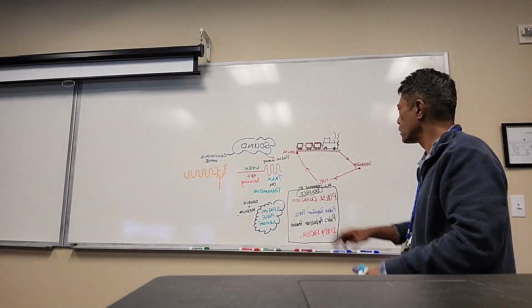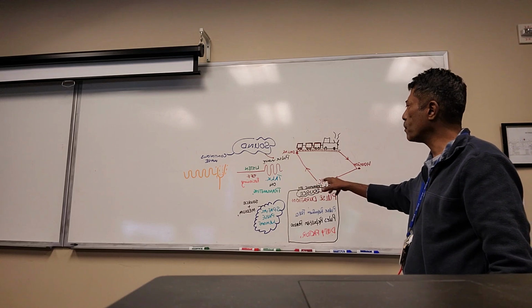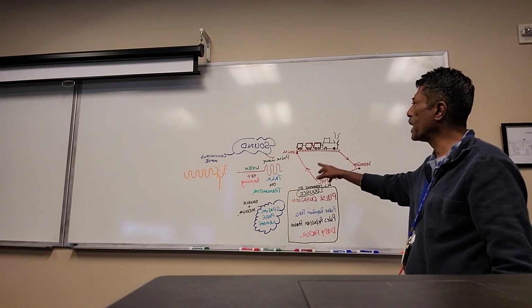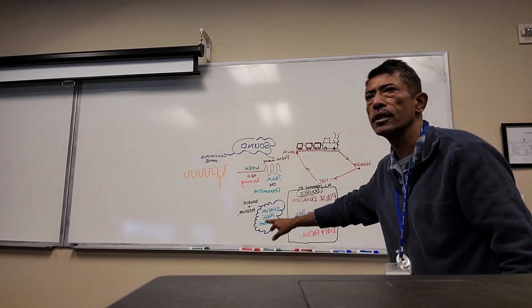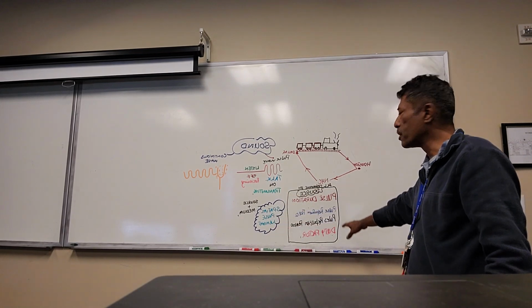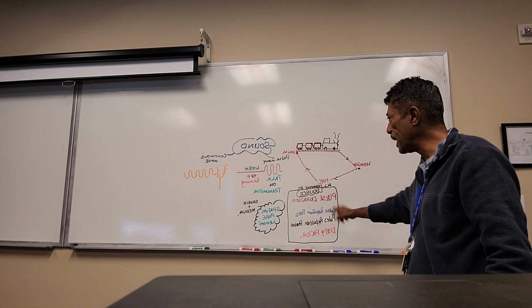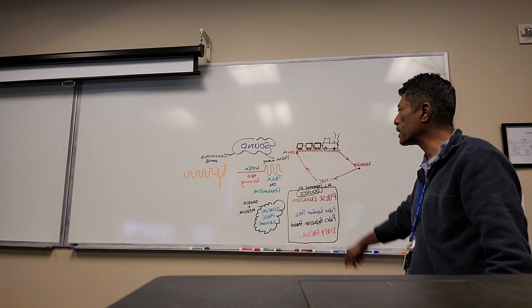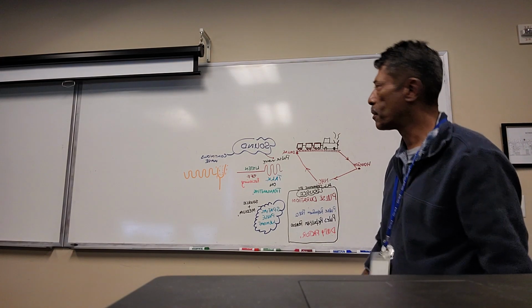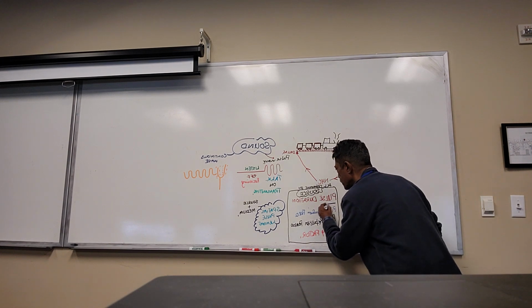So spatial pulse length is one of the parameters of pulse wave ultrasound that's determined by both the source and medium. The other parameters, pulse duration, pulse repetition frequency, pulse repetition period, and duty factor, are all grouped together because they have one thing in common. They are all determined by the source. Now these bottom three have something in common.